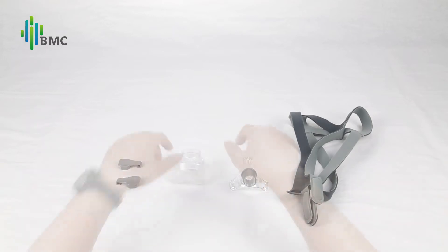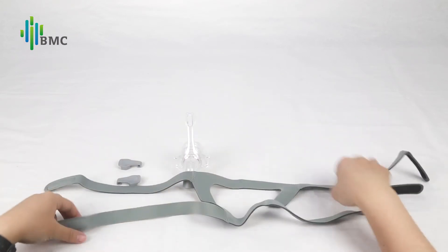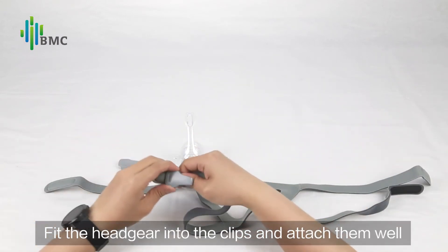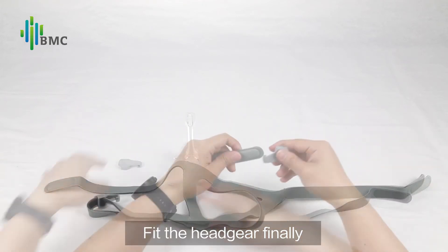Mask Reassembly: Insert the cushion assembly into the mainframe. Fit the headgear into the clips and attach them well. Fit the headgear finally.